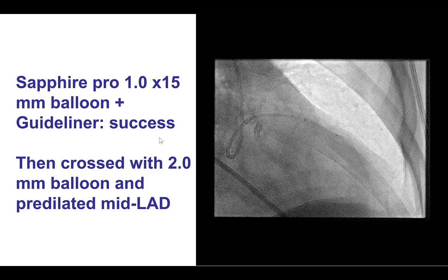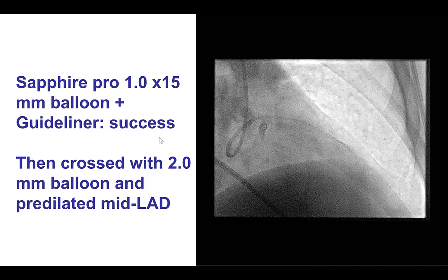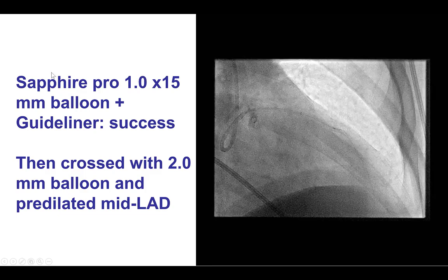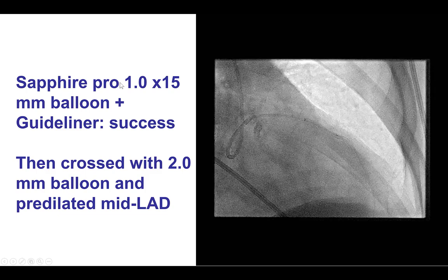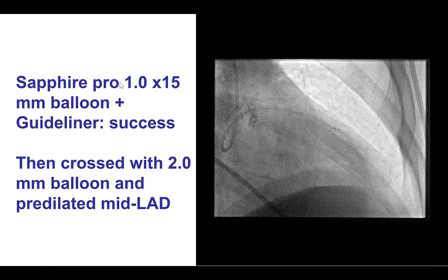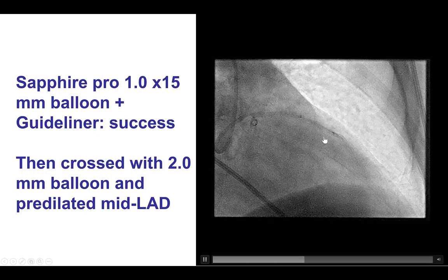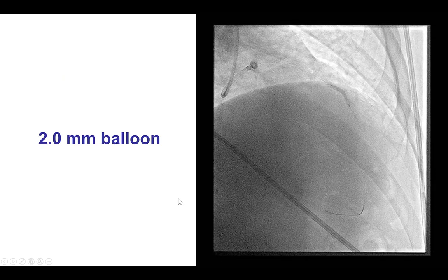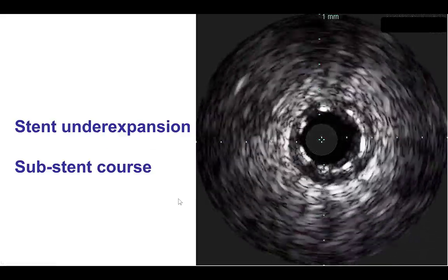We did not want to lose our distal wire position. Therefore, a 1.0 by 15 mm Sapphire Pro balloon, which is the lowest profile balloon currently available in the US, was used, and that could cross through the mid-LAD stent. Then there was dilatation, followed by a 2.0 mm balloon, which then allowed an IVUS catheter to get through.